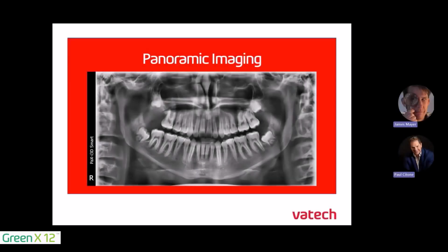So Jim, why don't we talk about some fundamentals of pan positioning and common things that can occur in your images? That sounds great, Paul. We just finished our patient positioning portion, and now let's look at images. And on screen here, I would consider this a high quality image. I've got my clear anteriors, a nice smile there. My condyles are straight up and down. So the question is, what do we look for in pan IQ?